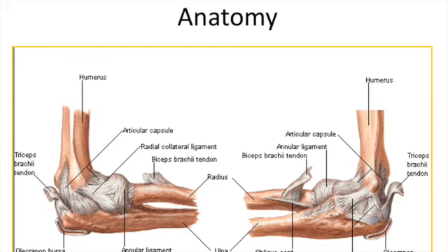Those are going to be very different pictures. We're going to understand and realize where each of those structures are going to be viewed, either through an AP or a lateral x-ray. So we need to be very confident when we're making these decisions. Like I've told you many times in the past, I'm not teaching you based on where this profession has been. I'm teaching you based on where this profession is going. So we need to be very confident with making those decisions as clinicians for diagnostic imaging.